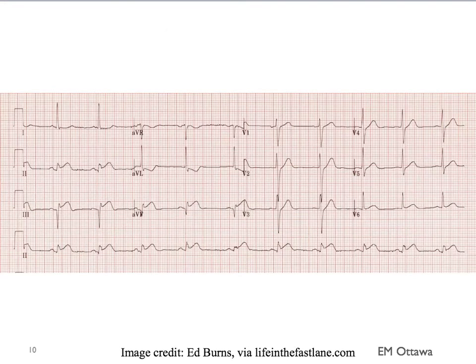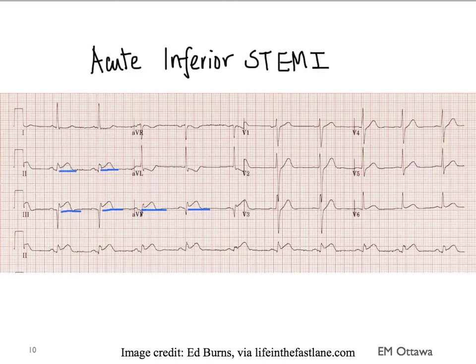Let's look at this ECG. You can pause here to decide where the ST elevations are and whether they belong to the same territory. The ST elevations are in leads 2, 3, and AVF — that is the inferior portion of the heart. Therefore, this is an acute inferior ST elevation myocardial infarction.